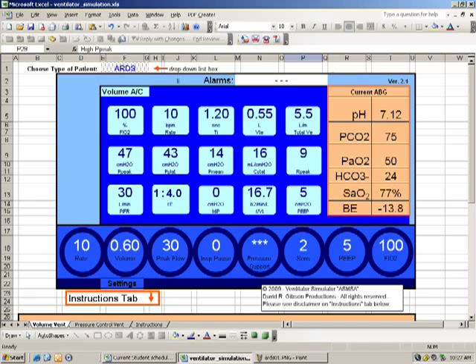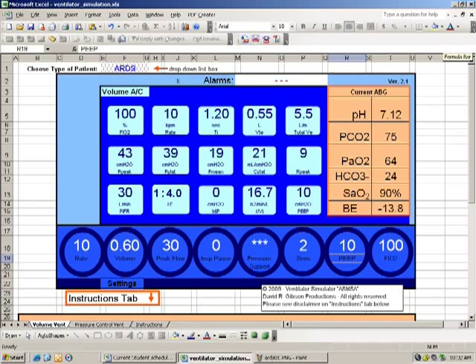Now immediately the students noticed the second biggest problem. And that is on our blood gas, our SATs are only 77%. Of course, that has to be dealt with. And the students knew rightly that it was going to take PEEP to deal with that. The students knew that PEEP is indicated when the PO2 is less than 60 on greater than 50 or 60%. So they added another 5 of PEEP, bringing the PEEP up to 10. And now that has helped quite a bit. Our SATs are now at 90% and we can turn our focus to something else.